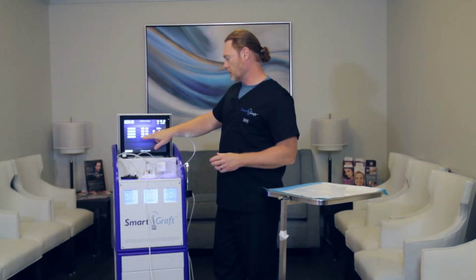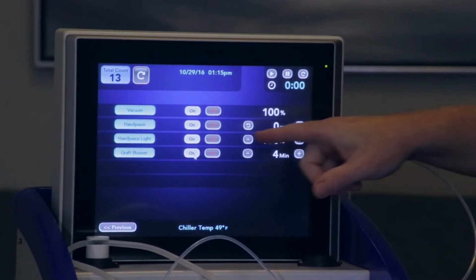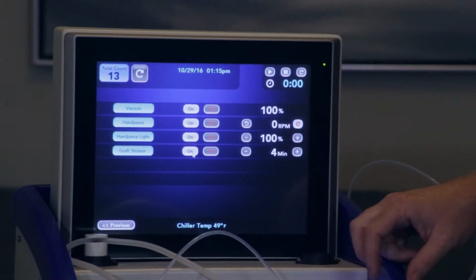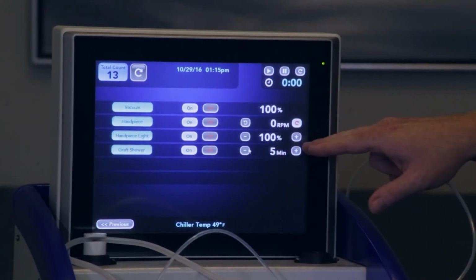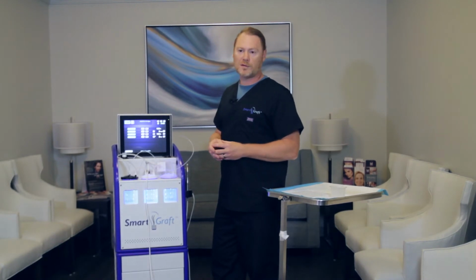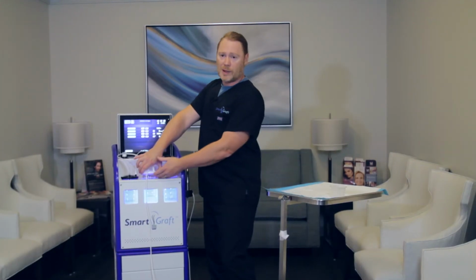The last one is actually the graft shower, and you want to hit that on button. Like I said previously, you can change the amount of time that is in between rinsings of the grafts themselves, which just is a simple depression of these buttons, more or less. Most people opt to use between 4 and 5 minutes. It's really going to be up to you how often you want them to be showered. Just keep in mind, the more that you shower them, the more saline is going to go in here, and you really just need to pay mind to how much saline goes into this.